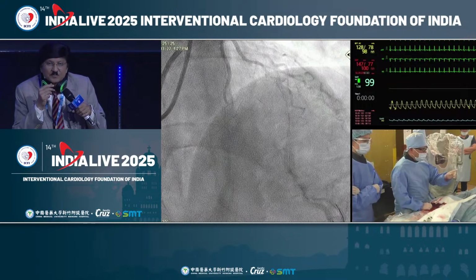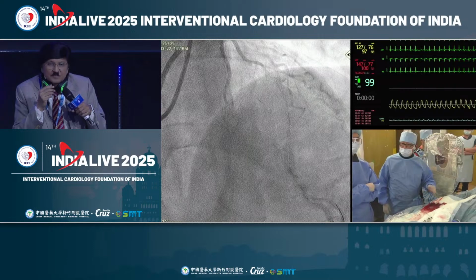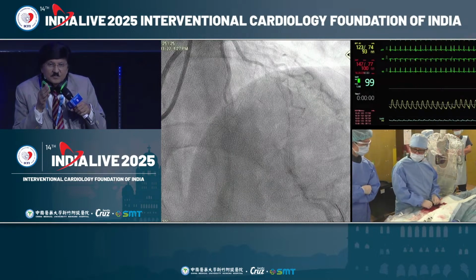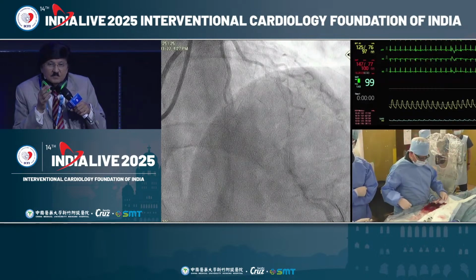Stop. Sorry, now some trouble happened. The rotablation console cannot work well, so now we changed to a new one. Please wait a moment.